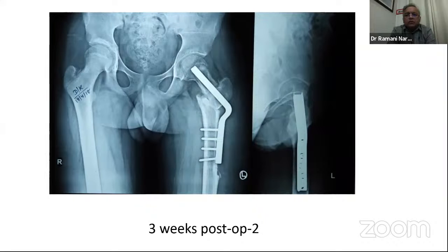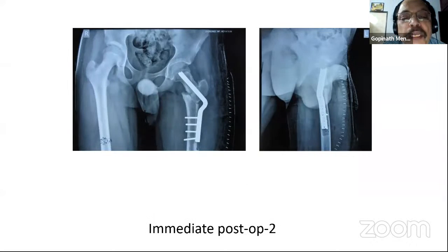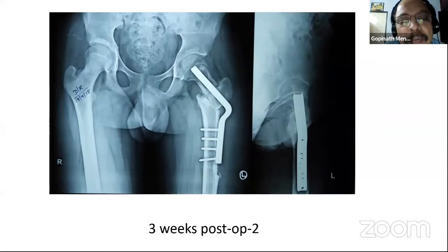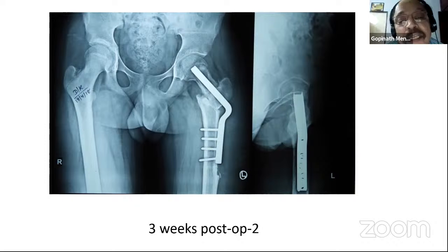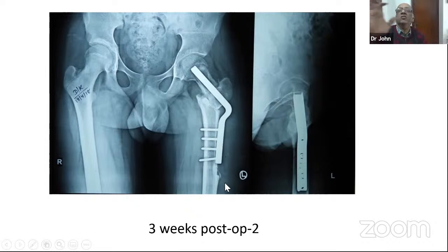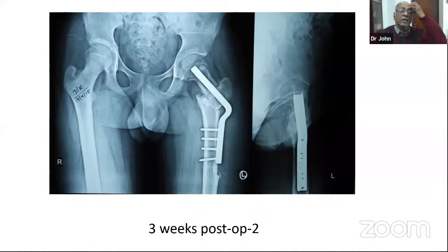Yeah, look. I think the plate, because the earlier plate was longer, the angle blade plate also could have been of that same size, at least probably a screw or so more distal. Because there's something that looks like a cortical defect there in the lateral aspect, just from conventional plates which tend to press on the cortex. So that is something to consider, because this could be a problem with a stress riser. But these osteotomy plates are not available in longer sizes very easily, unfortunately.